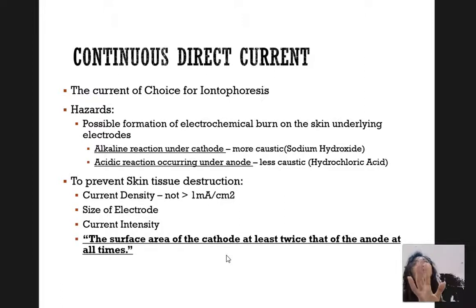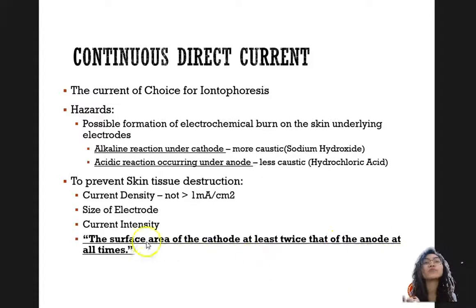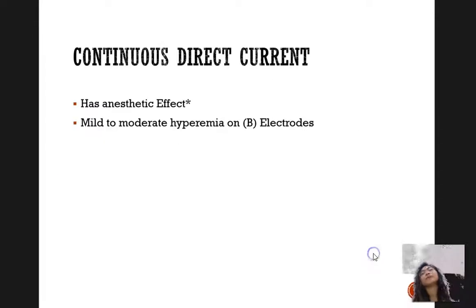So, if ever ang gagamitin nyo is anode electrode, may cathode electrode kayo na i-attach. Like for example, ang a-applyan nyo would be deltoids. So, yung active electrode, kunwari is anode, nasa deltoid. Tapos si cathode, ilalagay nyo lang siya a bit near to it, pwedeng upper traps, just to be able to complete the current. Yun lang naman. And ito ang ating rule of thumb, huwag kakalimutan: dapat mas malaki si cathode than the anode. Okay?